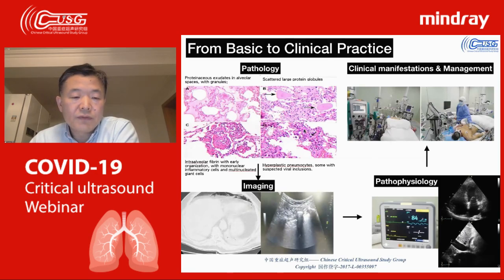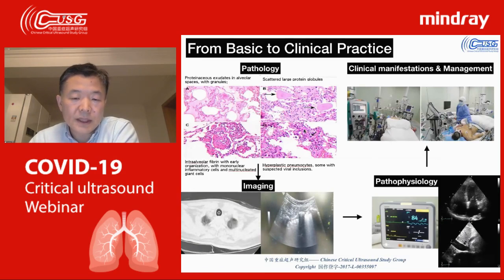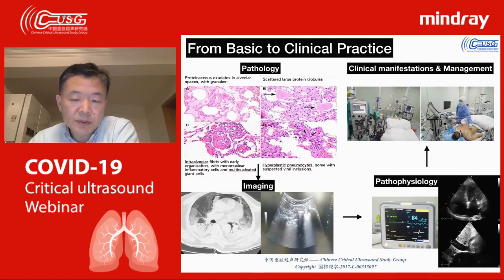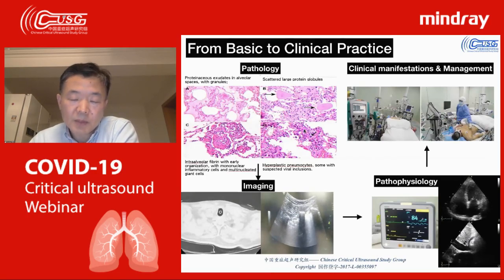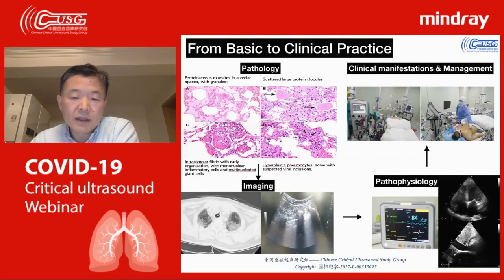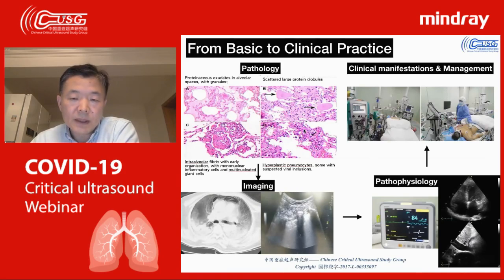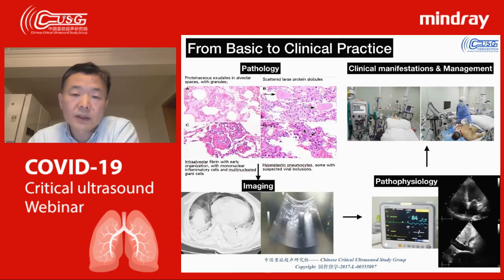If you put this information together, then you can think about pathophysiology, and use other information together like cardiac output, hemodynamic information, monitor data, prescriptions or interventions from your team, your nurses, your RT or other persons, and use this information together to make the right decision and give the patients interventions, like this picture from Dr. Zhu Ran.